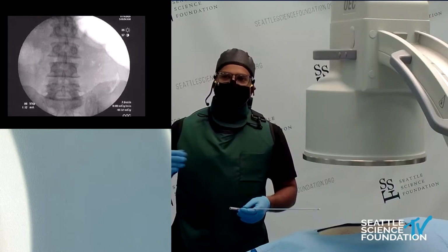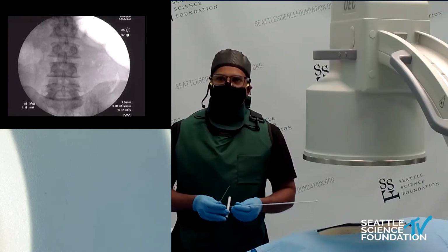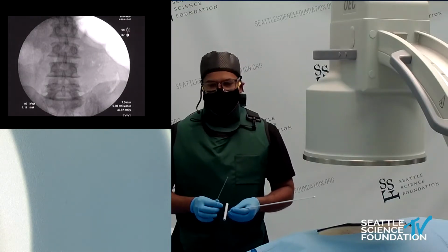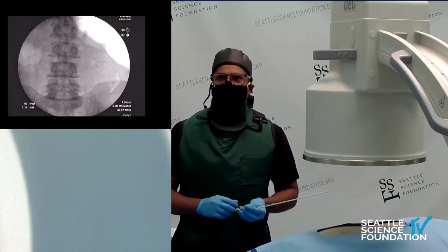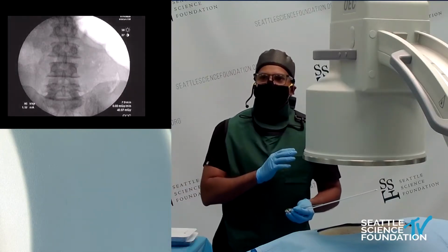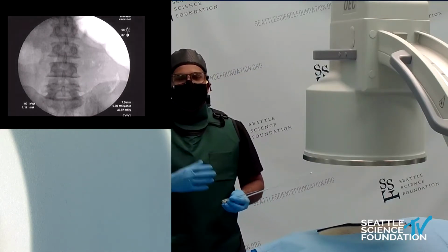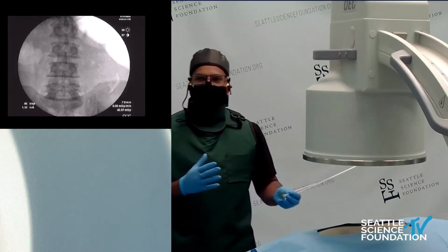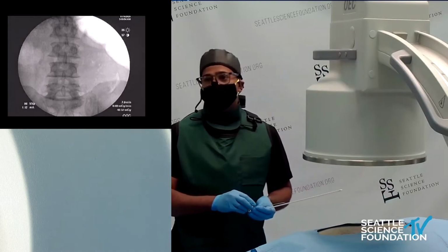The DRG is really where the cell body of the primary sensory afferent neuron exists. It's a very nice target because it can address that entire dermatome going all the way to your target. As opposed to spinal cord stimulation or dorsal column stimulation, where when you stimulate trying to get the knee, you're really going to be diffuse and may cause stimulation in places you don't want, and then not get the appropriate pain relief you're looking for at the region you're trying to target.